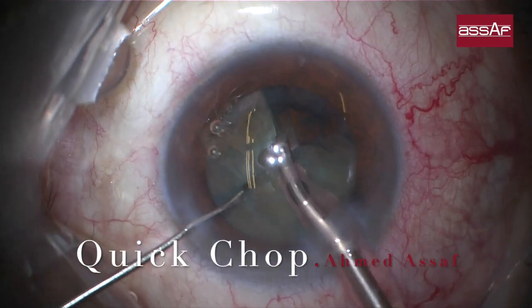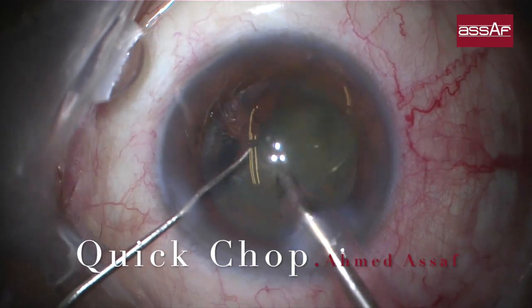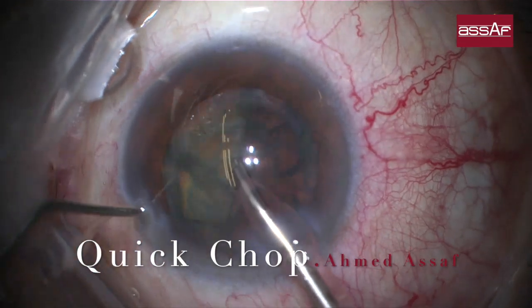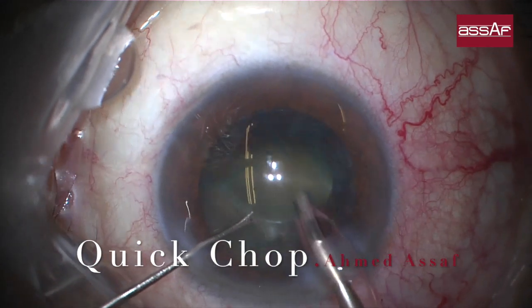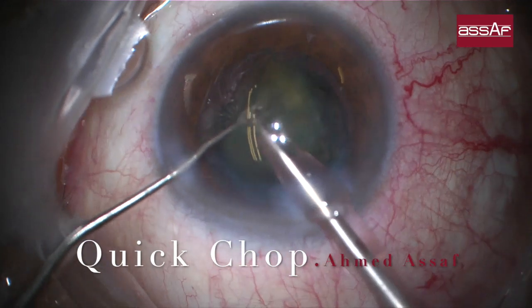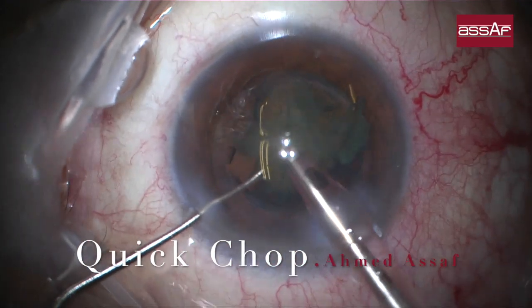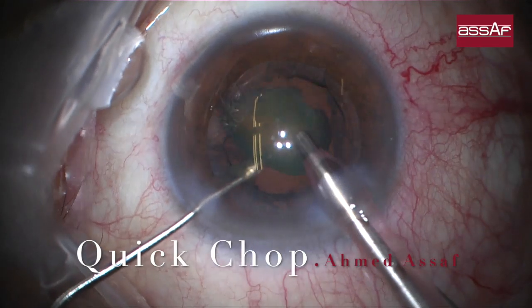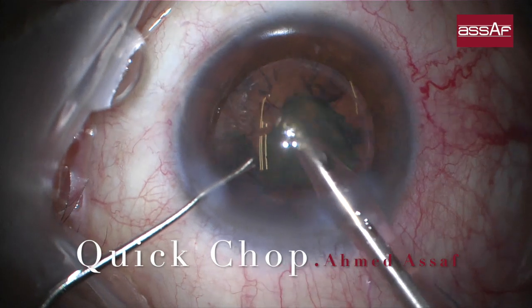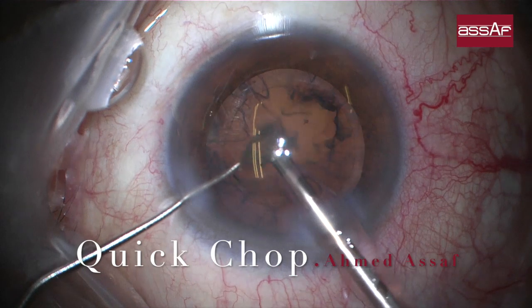The instrument used is a combo instrument — one side is the chopper and the other side is the nuclear manipulator, so switching between them is quick. Each quadrant is brought by high vacuum into the very center supracapsular plane to be emulsified away from the corneal endothelium and safely away from the posterior capsule. This non-edited portion of the video shows how quickly the procedure progresses with the quick chop technique.